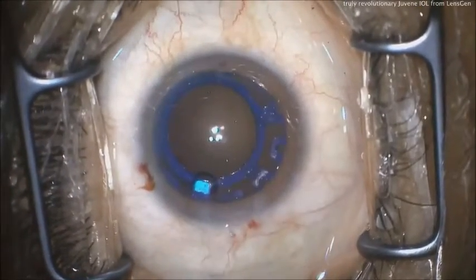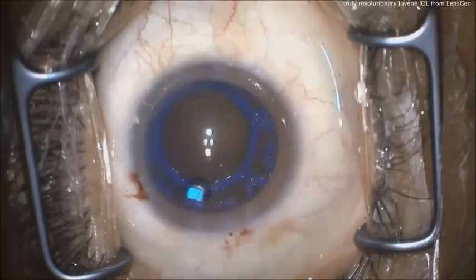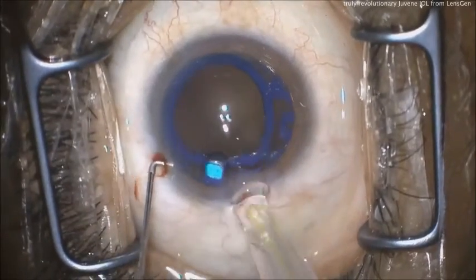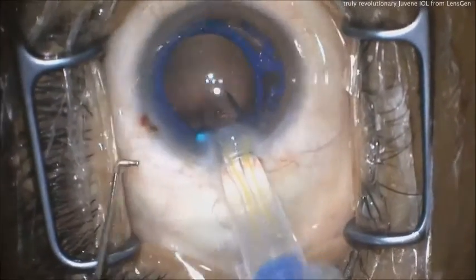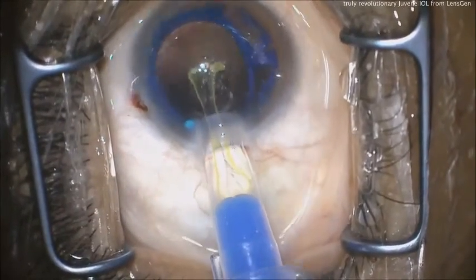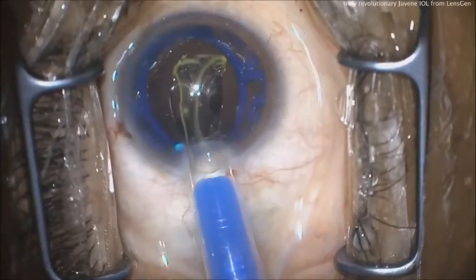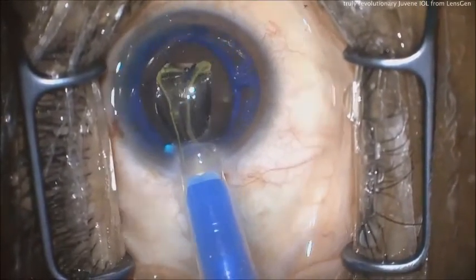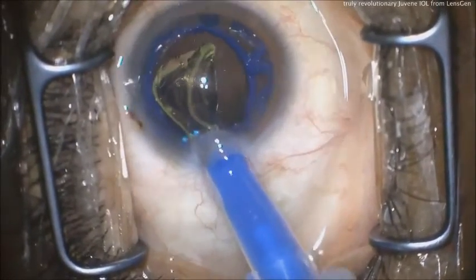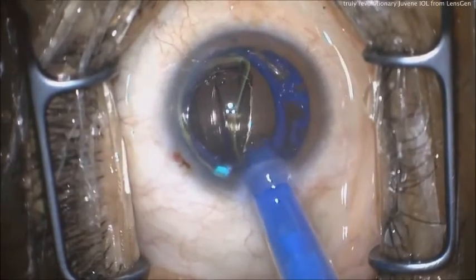The same injector is used to put in the front lens, or the power lens. This can be a toric power as well. It's filled with a very stable fluid, a derivative of silicone oil that the retina surgeons have used for many decades. The front lens has a yellow rim and the base lens has blue, so it's easier for surgeons to see when the front lens has been docked. The front lens docks at three different tabs.